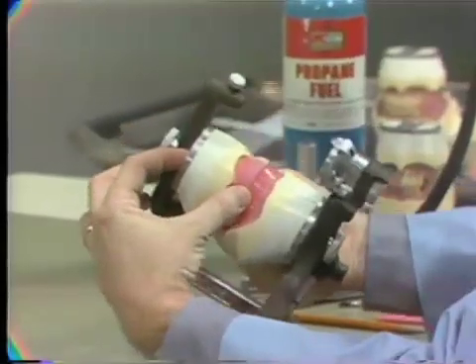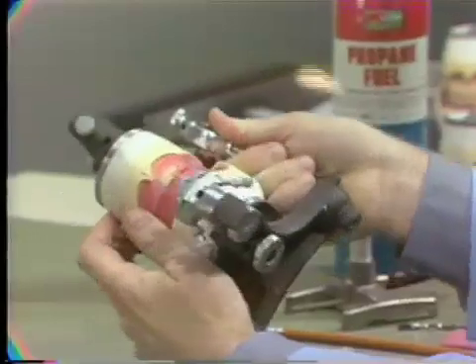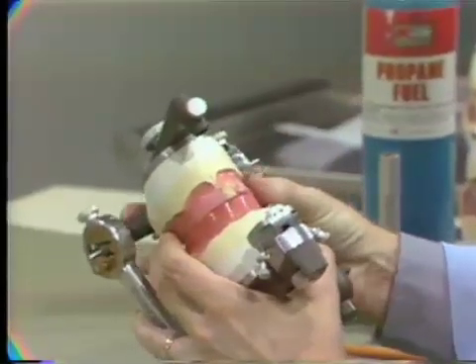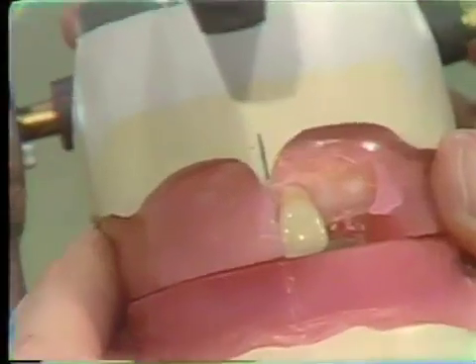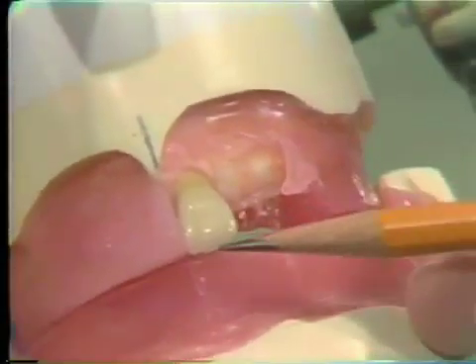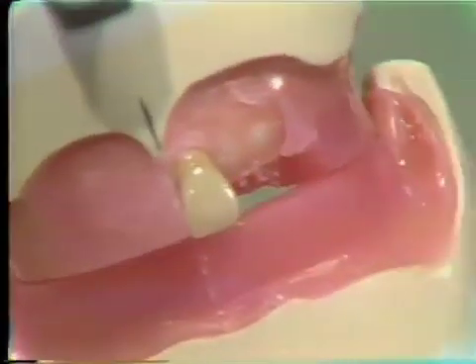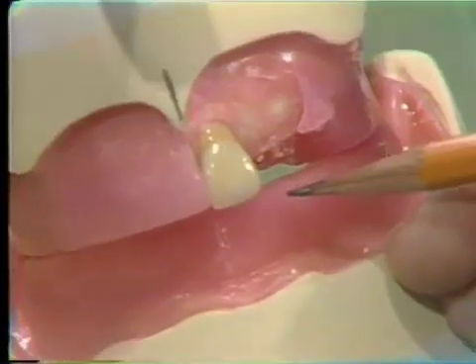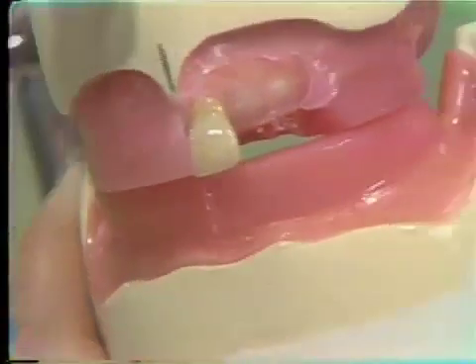Okay, now I think that at this point we are ready to take a more critical look at this tooth setup. At this point, the axis of the tooth, the vertical axis, is correct. The incisal edge should be parallel with the occlusal plane. But you'll notice at this time that I have dropped the incisal edge down about 1 millimeter. So actually it extends below the plane of occlusion 1 millimeter. And that is correct.